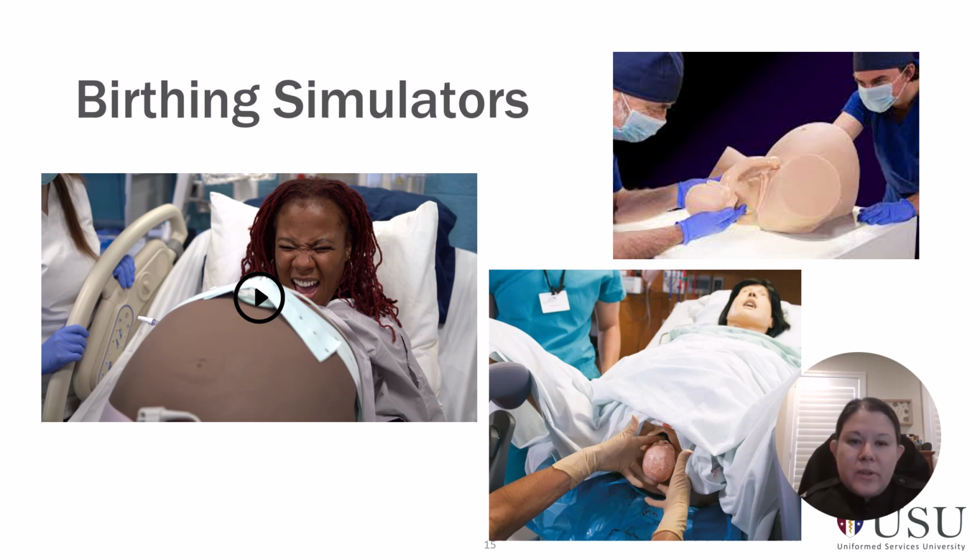And then there are birthing simulators where these are things that people can wear, and then you can incorporate a patient actor into the scenario. I will say the feedback from participants is generally the wearable ones with a real person interacting tend to be the most realistic from a participant perspective.